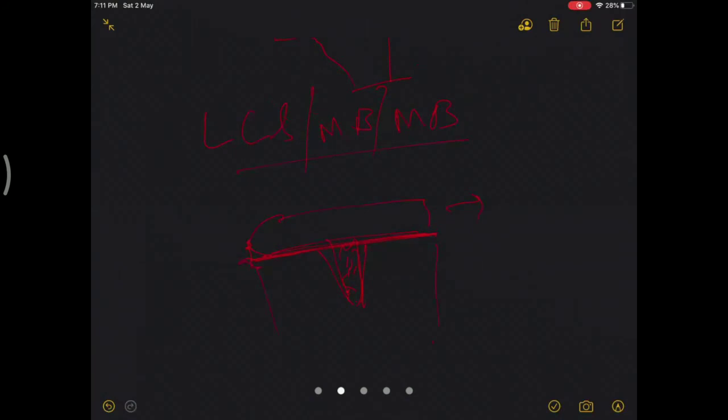Even if you have somehow internally rotated the tibia or have some excessive external rotation, this is free. This is not attached here. So the tibia, the poly will change itself to be congruent to the femur, and some leeway is possible for your errors in the component malpositioning.